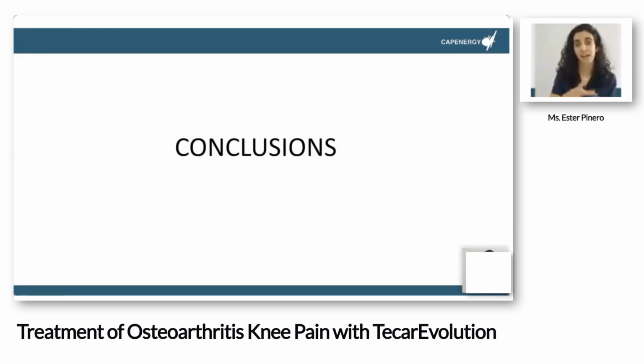It's for that this patient recovers the strength very quickly, because it's combining a good work of strength with the TECAR therapy. Okay? If you have a good nutrition of the muscle, when the muscle works, it will make more contraction, more quality of contraction, and then we will win very well this strength.